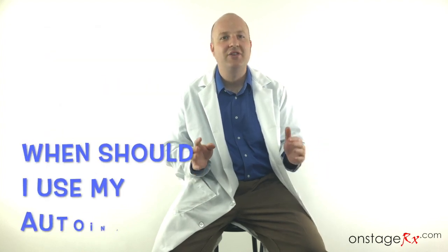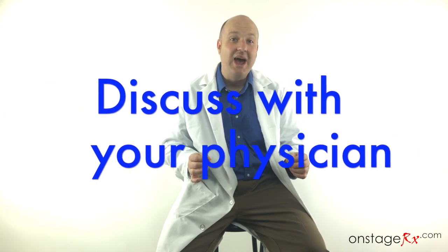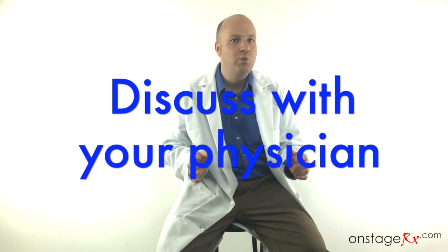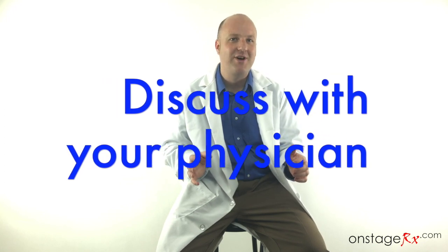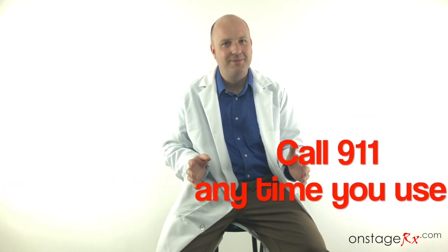Now, how do I know when I should use my epinephrine autoinjector? Well, it turns out that this is a very complex question, and there's no consensus from one professional medical group to the other. Some people believe in using an injector at the beginning of very mild symptoms, and others only when more severe symptoms occur. Because of this, I recommend you discuss this with your primary care physician, and be sure that you understand when they expect you to use your epinephrine autoinjector, and be sure to call 911 anytime you use your injector.